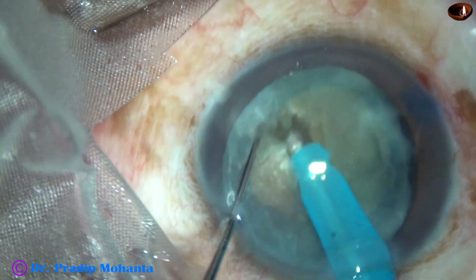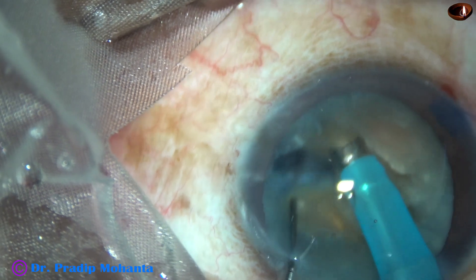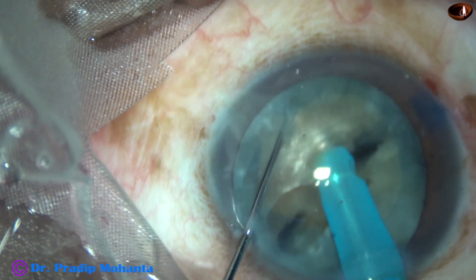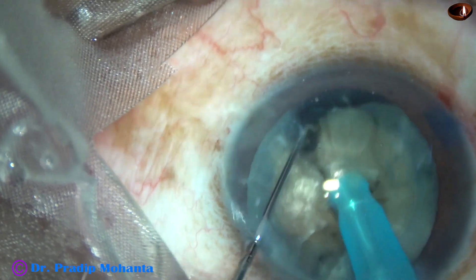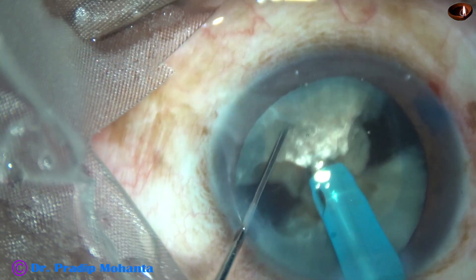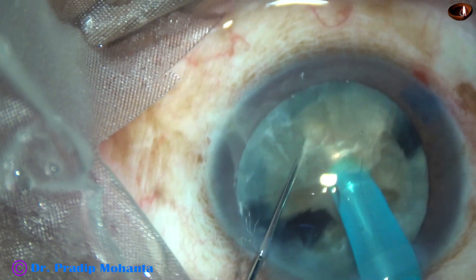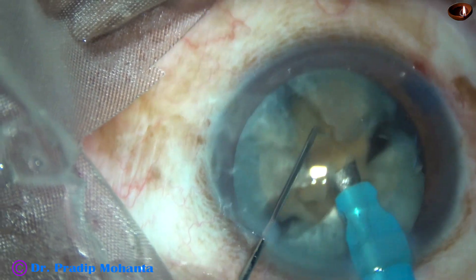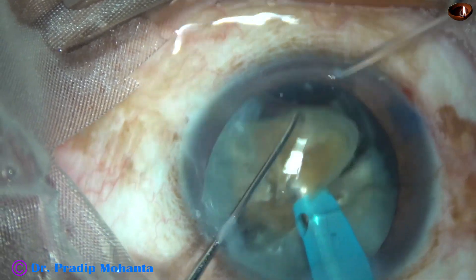Do some more sculpting to go to a deeper plane. Rotate 180 degrees, and along the initial crack I could divide the nucleus completely into two parts. This is the larger part — I am planning to divide this part into three pieces. This is the endonucleus, and this piece is being emulsified to make some room for the other piece to be mobile. This piece is also divided into two pieces. The endonucleus is removed and the two pieces are emulsified.